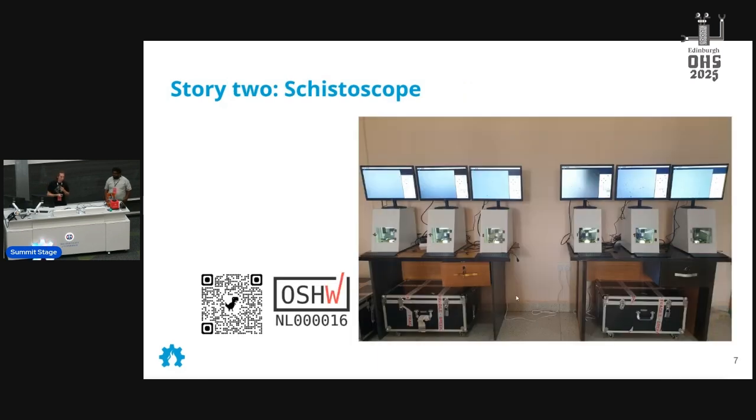As a research hardware engineer, this also gave me the possibility to talk with a lot of researchers and to learn about the projects that they do. One of which was JC Deal. He is a professor from industrial design engineering, and he ran this multi-year research project to do a smart diagnostic device, the Schistoscope, a microscope to determine if there's schistosomiasis eggs in a urine sample.